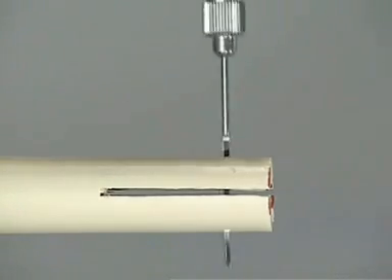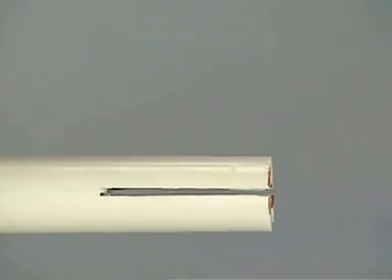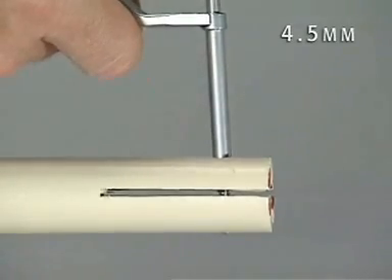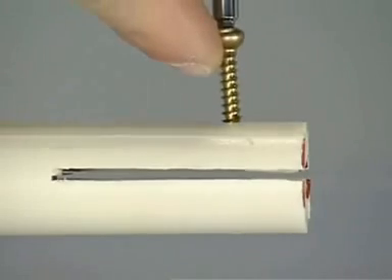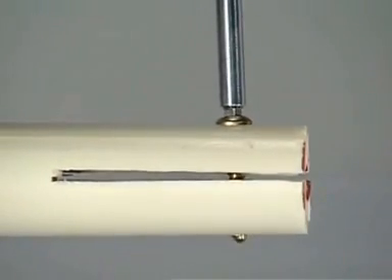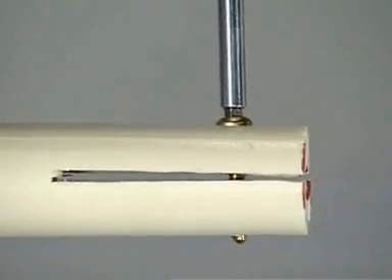The depth gauge is used to determine the required screw length. A thread is cut in the far cortex using the 4.5 millimeter tap through the drill sleeve. A 4.5 millimeter cortex screw is inserted. As soon as the screw head touches the bone, further tightening of the screw will lead to closure of the fracture gap and interfragmentary compression.